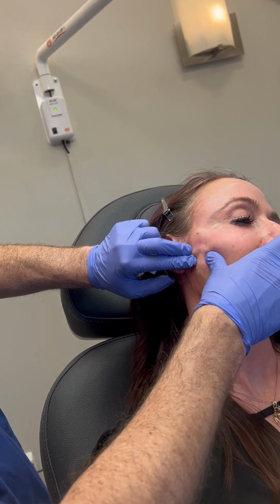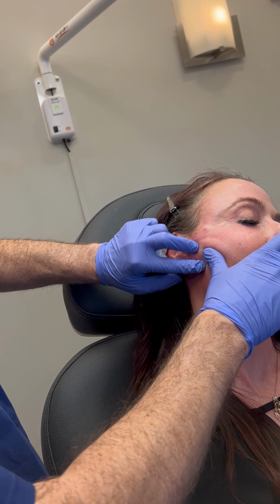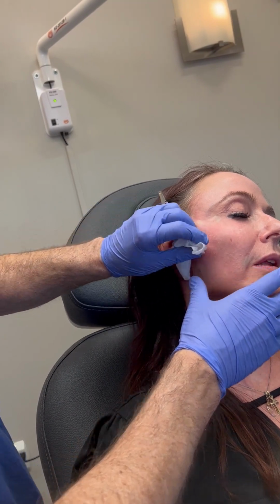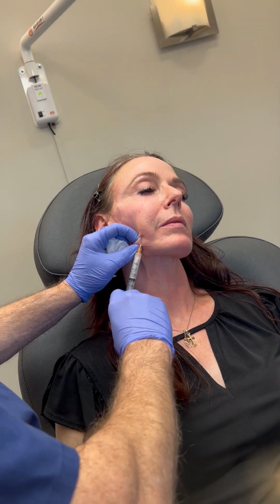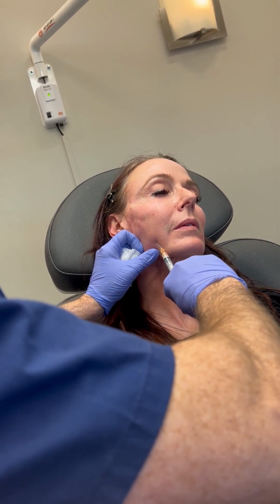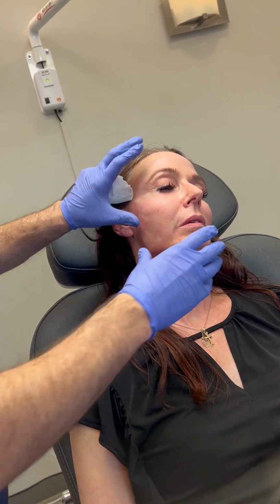So we'll do 2.5 again, and we're going to go into the buccal area, which is also hollow. Her cheeks look pretty good, so I don't really think she needs it right in the cheek. She needs the areas around it. So again, we're going to do a hydrodissection type technique, and we're going to push forward 2.5 cc's, fanning technique like that. Here we go. Good.